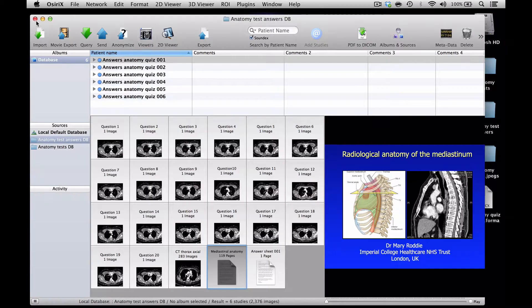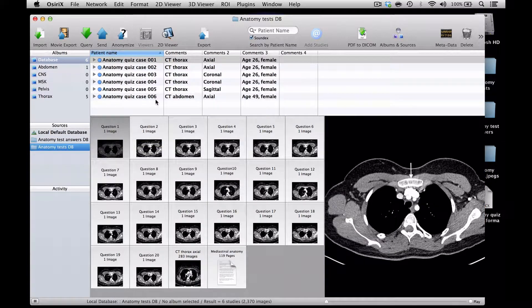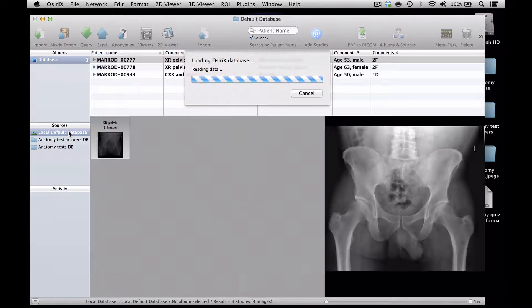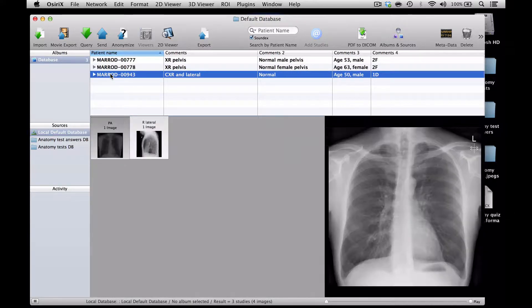So how do we go about creating such data sets? It's very easy. I would generally start by looking at my current test sets, and I can see that the last one was case 006, so the next case will be case 007. I'll start off by loading a normal anonymised case into my local default database, and for the purposes of illustration here we'll use this normal chest radiograph.